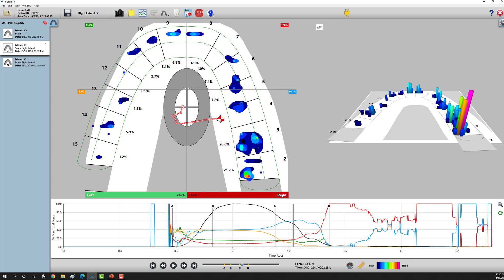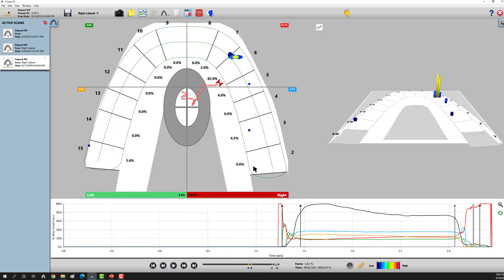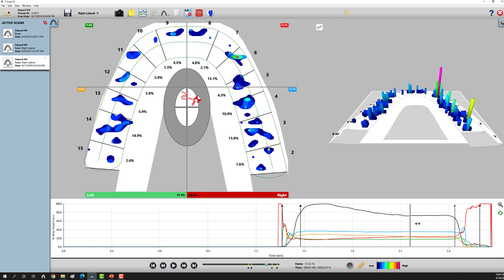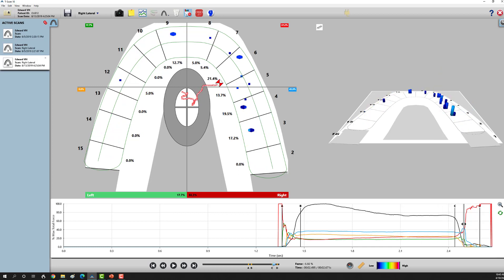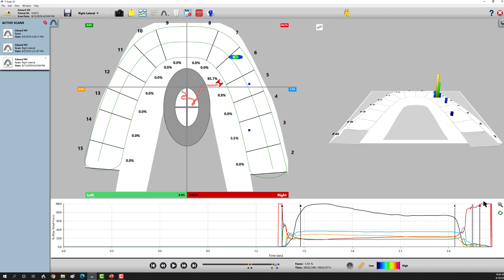You use the computer to help guide where the interferences are. This looks like the palatal cusp of two or one of the lingual cusps of 31. Mid-treatment, what you'll notice when we go into an excursive movement right here is the canine takes over. The red quadrant takes over and goes up, while all the other quadrants go down. Why is this important to get a handle on?